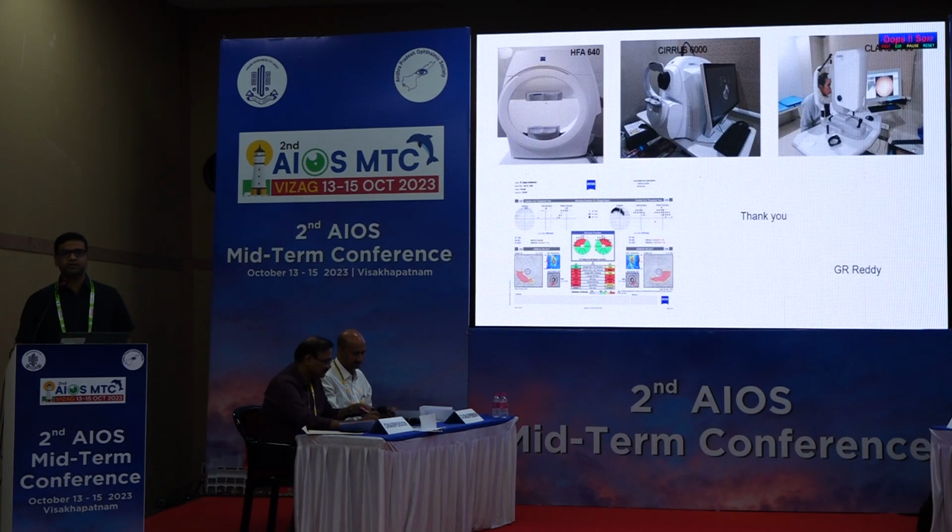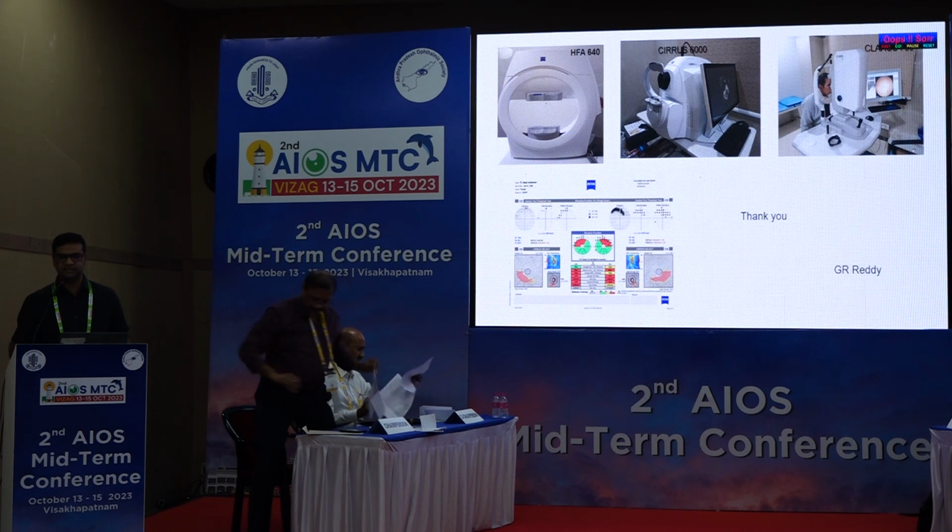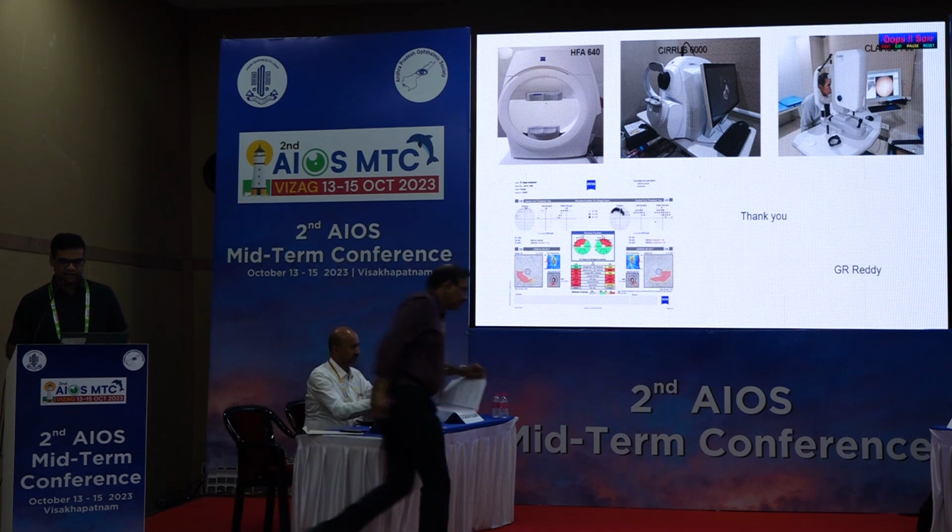What is very important is that even when patients have very severe disease, it is important to do GCC in every patient with glaucoma to evaluate the scotoma, whether the scotomas are deep or superficial. Even if there is severe retinal fiber loss, sometimes it may not be appreciated on the visual fields. So GCC can help us in evaluating a glaucoma case. Thank you.